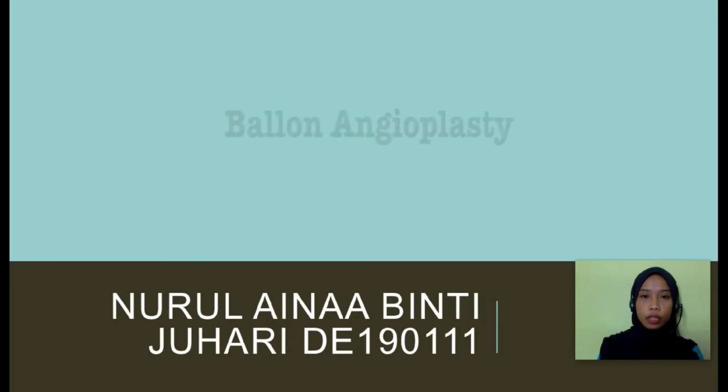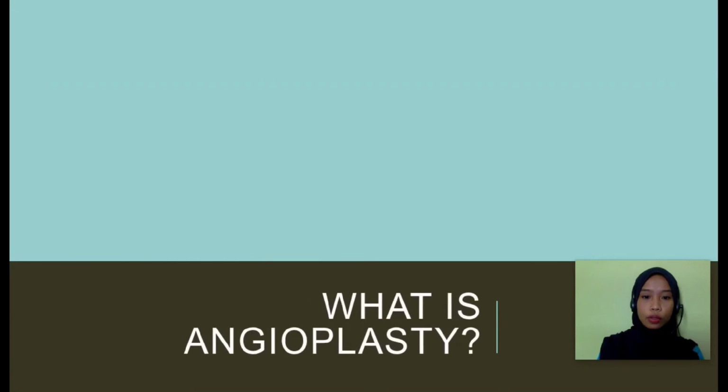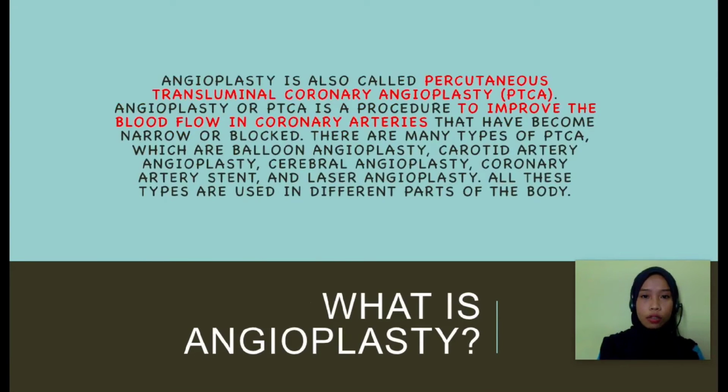So our group will explain the balloon angioplasty. So we go to what is angioplasty. Angioplasty is also called percutaneous transluminal coronary angioplasty, or PTCA. Angioplasty or PTCA is a procedure to improve the blood flow in coronary arteries that have become narrow or blocked.